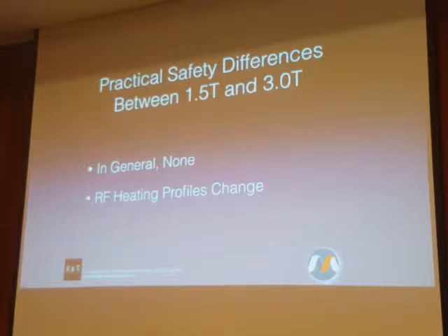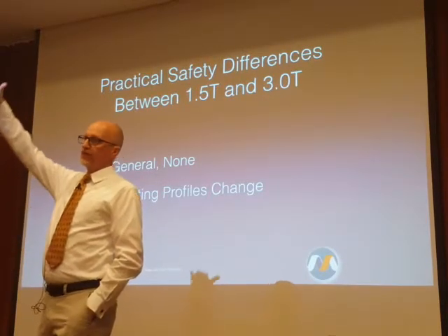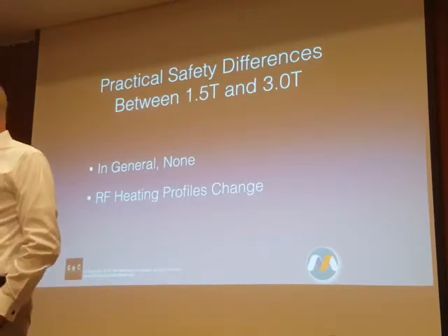But then there may be other conditions that are bad, and we don't necessarily have to be at the worst case to produce a negative outcome. The general rule is as field strength goes up, we start worrying about smaller and smaller electrically conductive items.